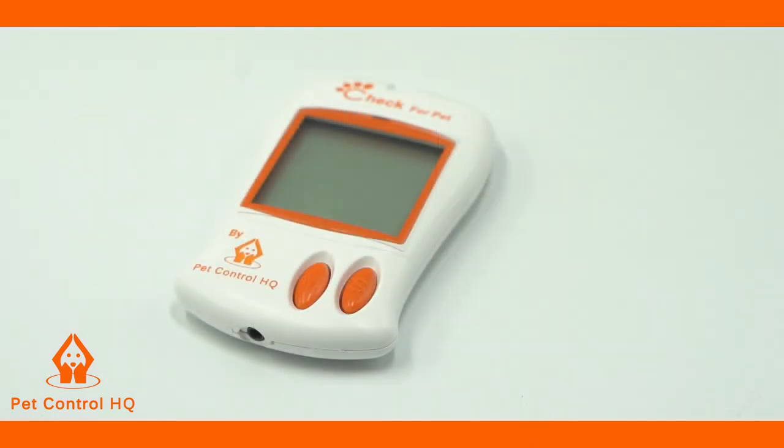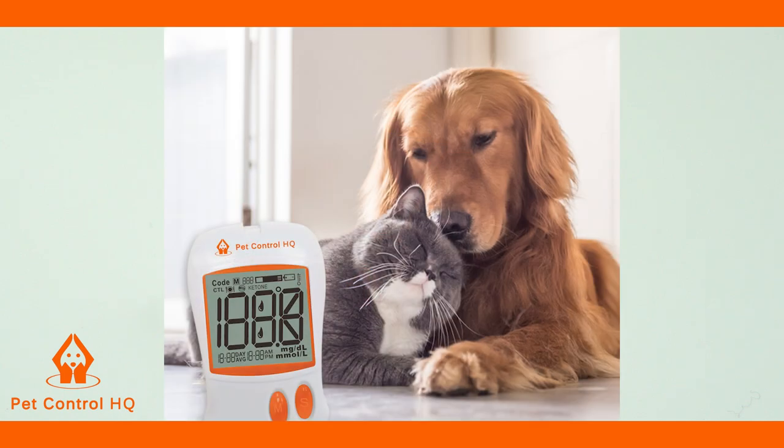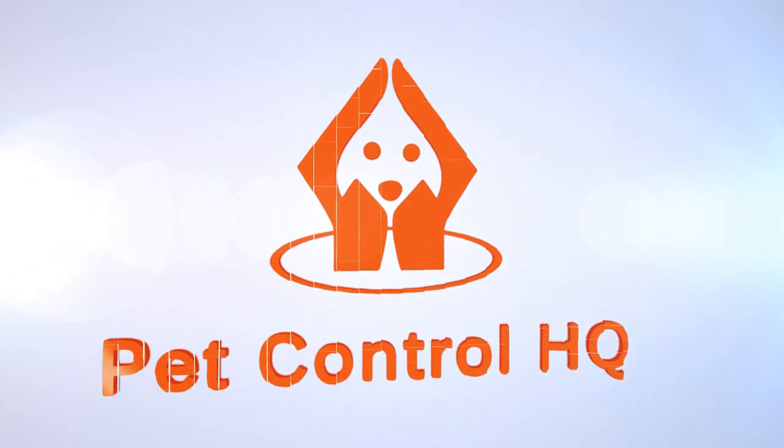Congratulations, you have successfully completed the control solution test for the PetControl HQ blood glucose monitor system. You can now confidently monitor your pet's blood glucose readings in the safety and comfort of your home.